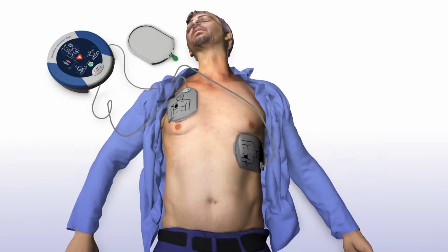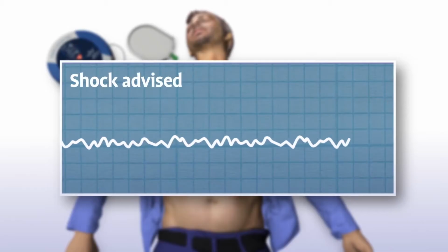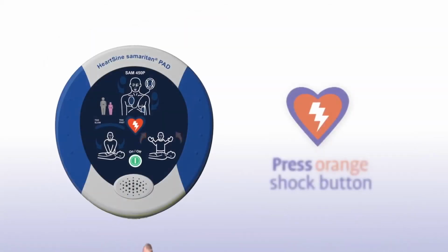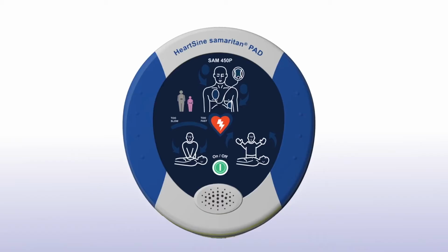The Samaritan PAD automatically assesses the patient's heart rhythm. Assessing heart rhythm. And recommends whether or not a shock should be delivered. Shock advised. Stand clear of patient. Press the orange shock button now. Shock delivered. When performing CPR, it's important to apply effective chest compressions for each 2-minute cycle as directed.